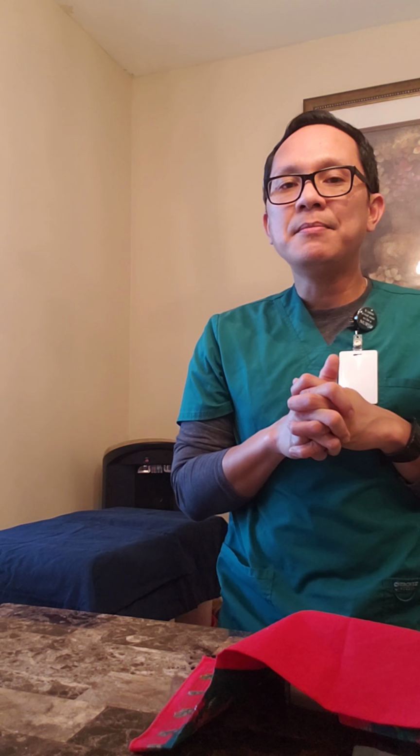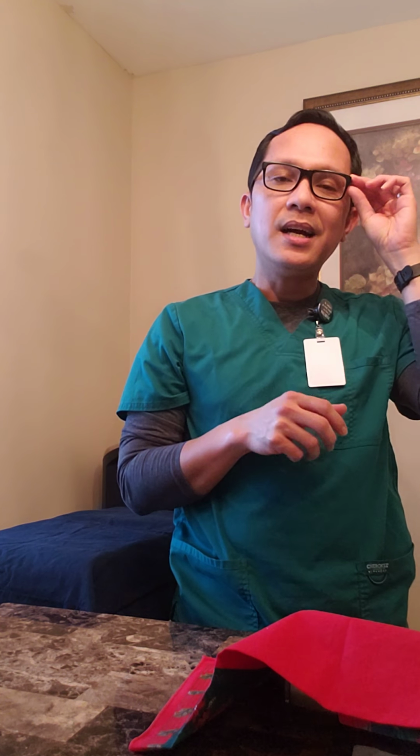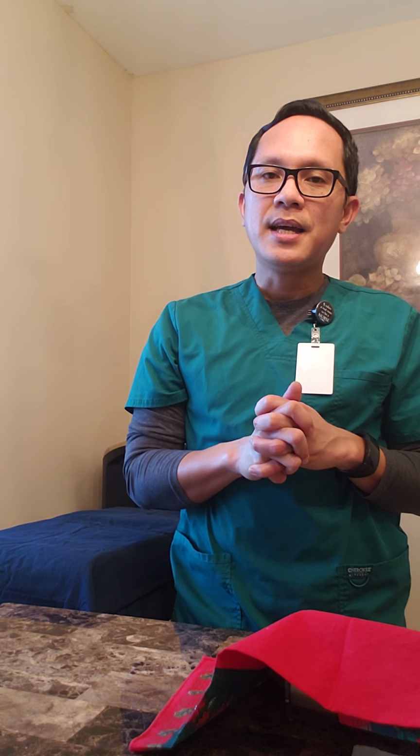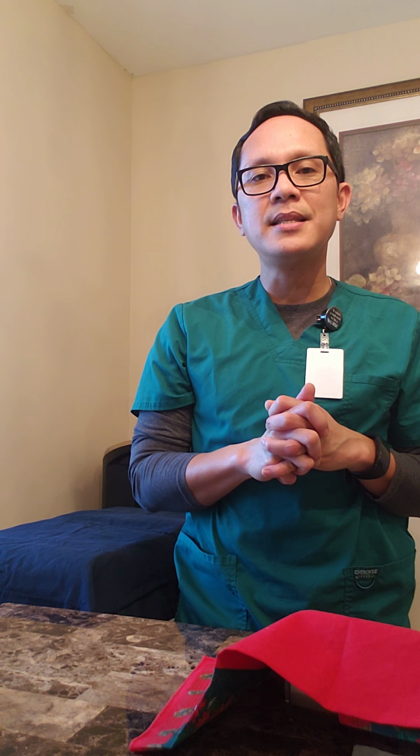At this point in time, I'm just going to go ahead and check on my patient in her room. I'm going to explain to her that the doctor ordered the procedure, and if I can, do a skin assessment on her before we do the bladder insertion, especially in the perineal area, for any signs of redness, developing sores, or any rashes forming in there. And the patient also has the right to refuse.